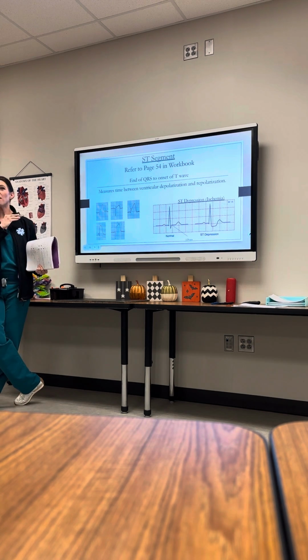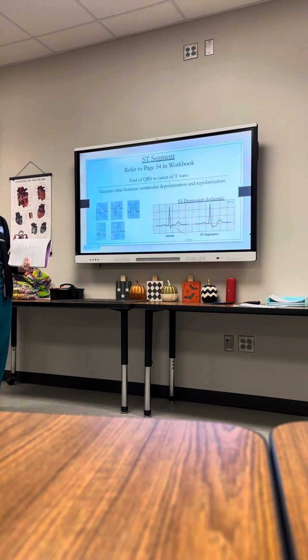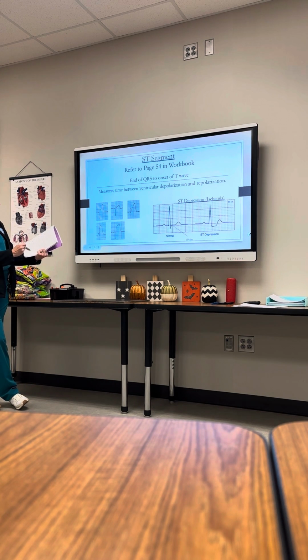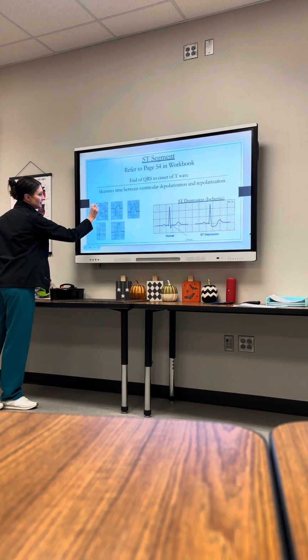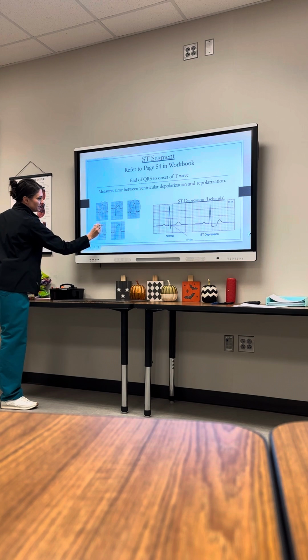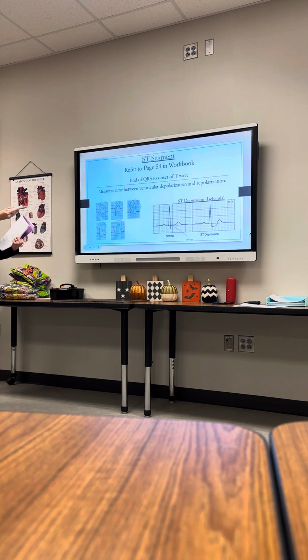This one is commonly used to help us assess if a patient is having a myocardial infarction or any type of ischemia. Let's talk about the left side of the slide here, and I want you to write this in your notes section. If we see something along these lines, you're getting lots of examples here, this is ST elevation.